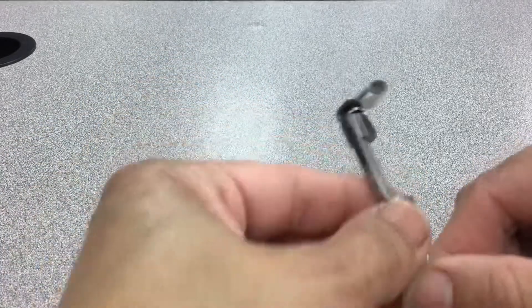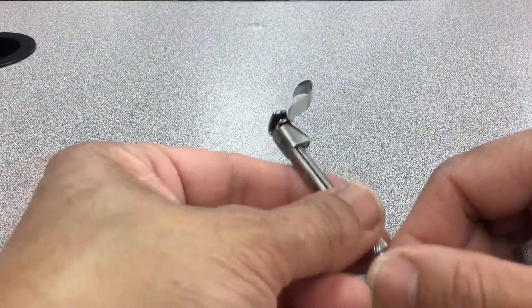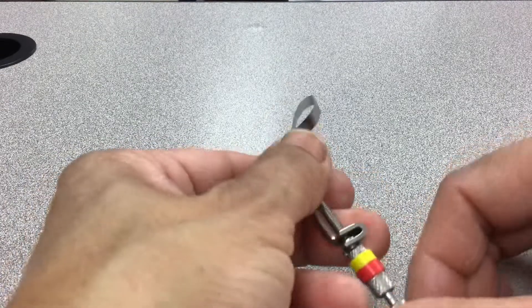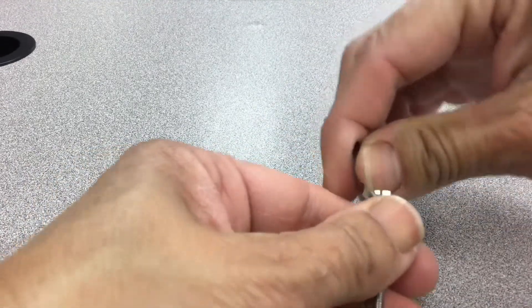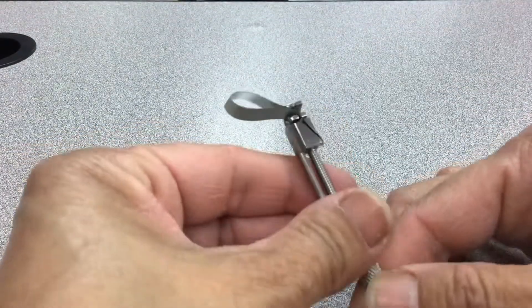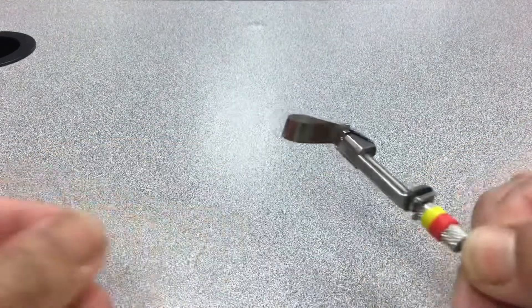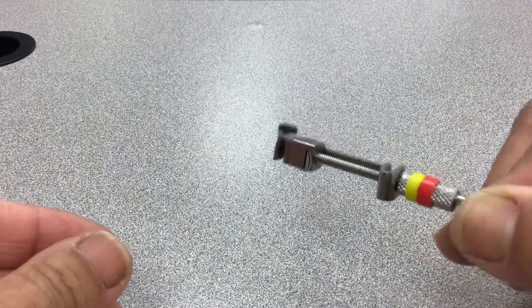Okay, same with the other side. Go to the other side, hold it, push it. So now we got the upper left and then lower left.